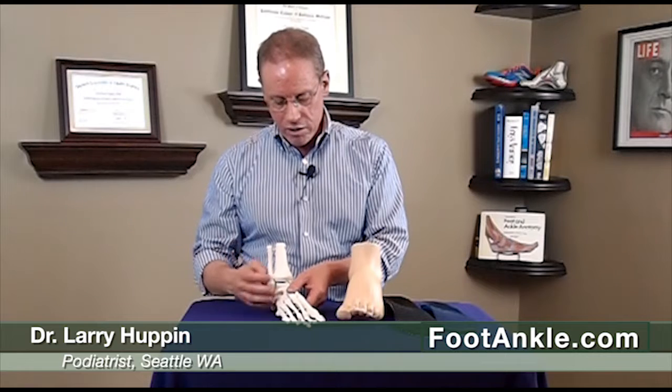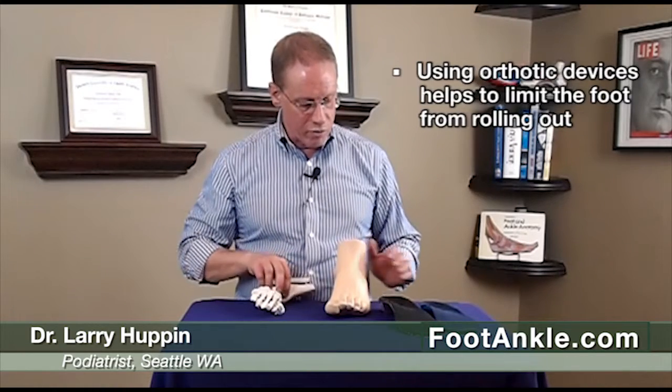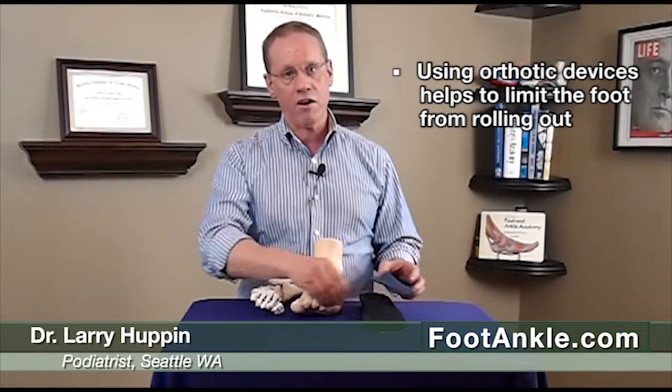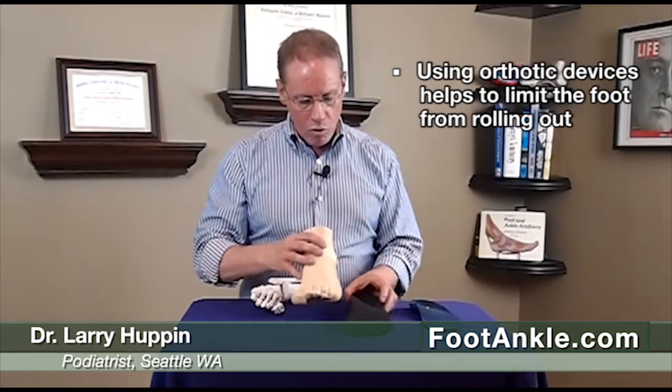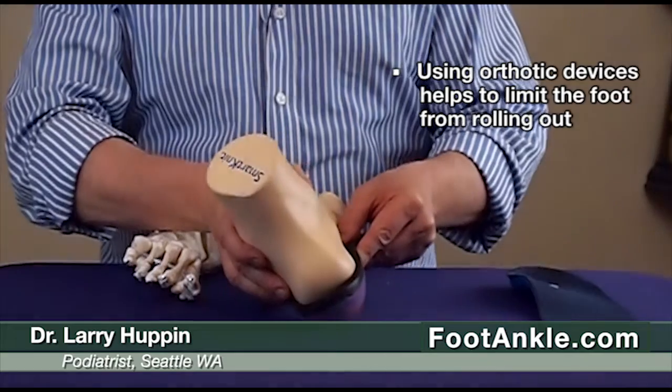So what we're trying to do in this situation is stop that foot from rolling over that way so much. There are a couple different ways we do that. Normally we're going to use an orthotic device, either a prefabricated orthotic like this one, or if that's not effective enough, we can make a custom orthotic. Our whole goal here is to limit that excessive rolling of the foot.